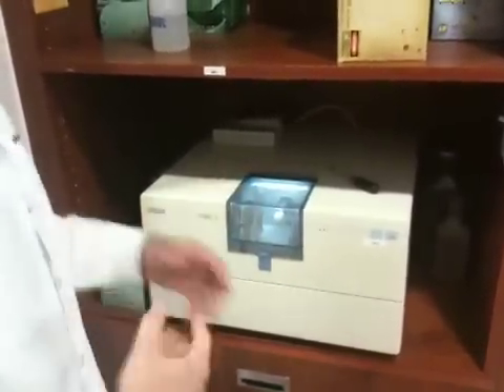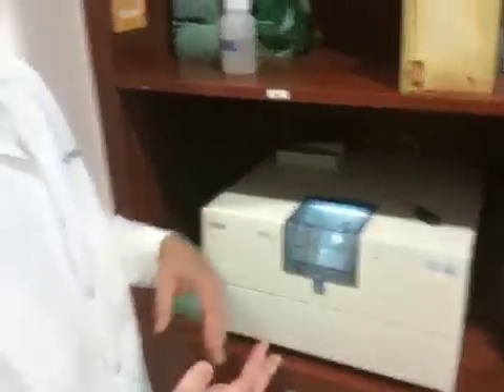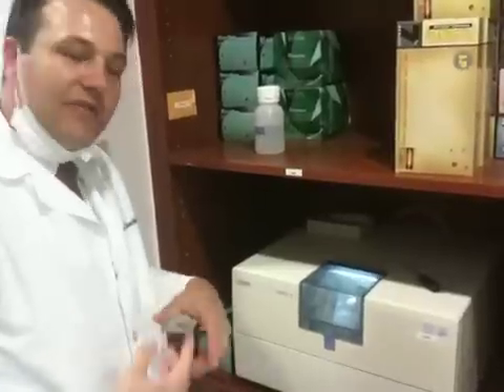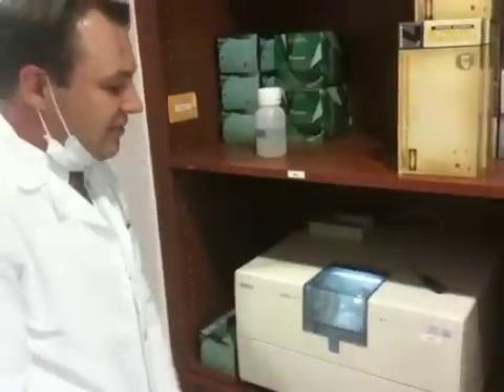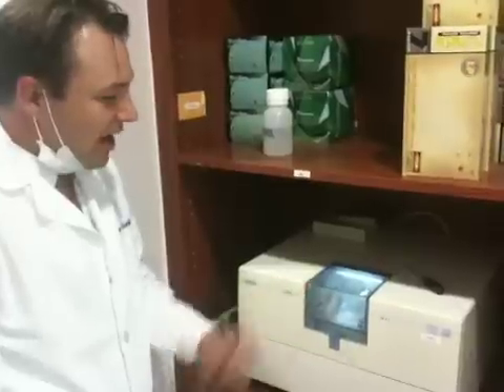The computer is going to go through a quick minute-and-a-half process to calibrate, to make sure there are no defects in the block, that it's mounted correctly, that we put the right size block in, and that it can make the tooth. After that, it's going to start spraying demineralized water with some really expensive vegetable oil to keep the friction down. In about 17 minutes, our tooth is going to fall off and be ready for a little polishing and cementation.